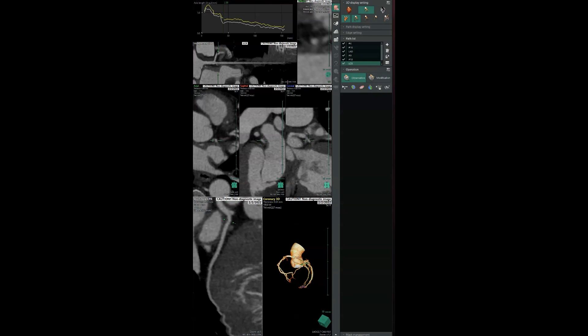The coronary arteries have a curved shape. By utilizing sophisticated 3D post-processing computer software, we can stretch the vessels and evaluate for disease, or what we call plaque. Normally the vessel should be nice and clean and free from plaque. Initially plaque is soft and dark, but over time it can calcify and become hard and bright. Our job as radiologists is to report the presence of plaque, grade it, and determine whether it is causing a narrowing or blockage of the vessel.